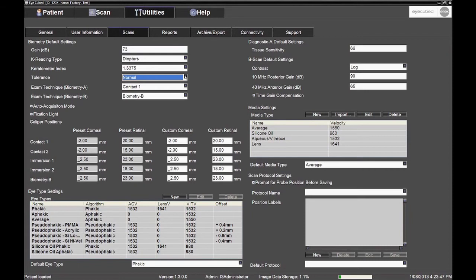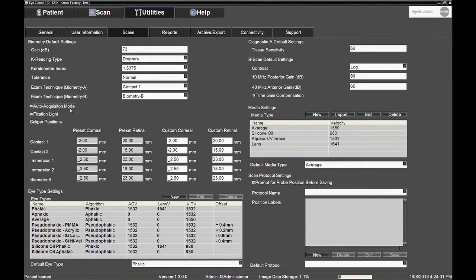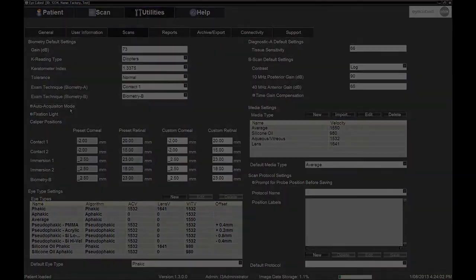but it will also look for the scleral echo, as well as analyse the quality of the retinal echo before saving a scan. It is especially critical to select Normal when working in auto-acquisition mode to guarantee consistency and accuracy in the axial length measurements.